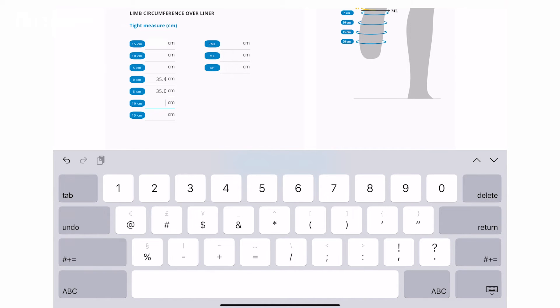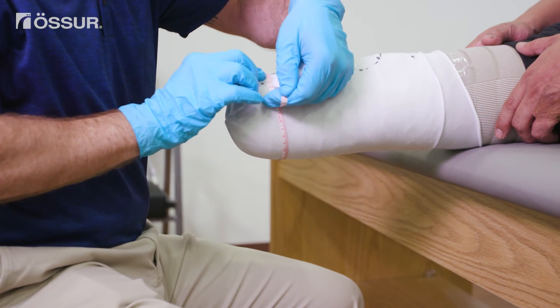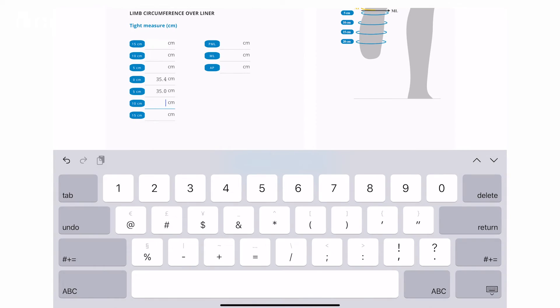Move down to the next marked location, take the measurement, and enter it into the portal. The circumference for this location is 34.8 centimeters.